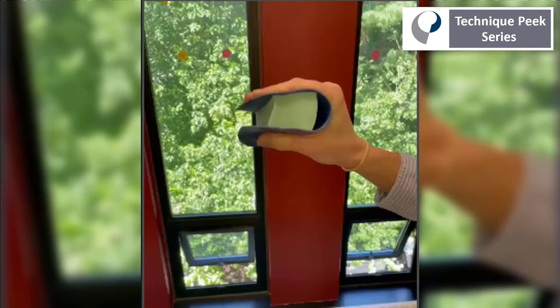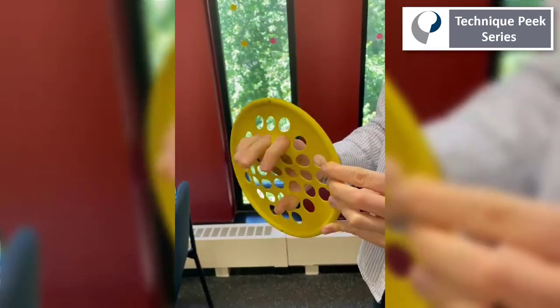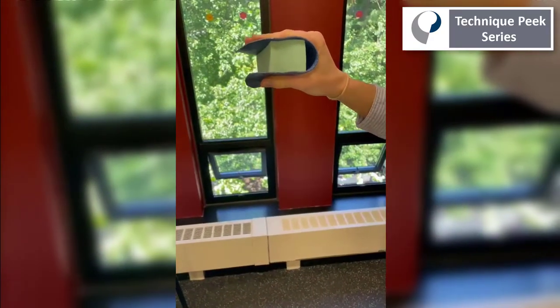How many times do we try to get a patient to do intrinsic gripping in the web, and this is what we see — flexion at the IP joints. For some patients it's really hard to get that motion pattern down.